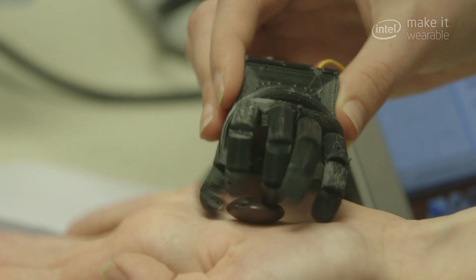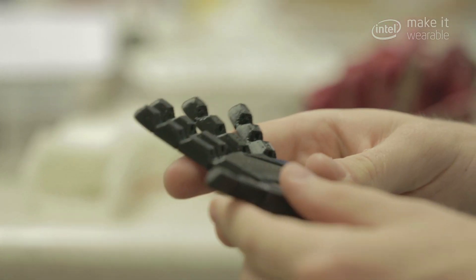Jacqueline was saying that if she had a robotic hand, she just wants to be able to tie her hair back. It's such a small thing that we all take for granted, but it makes a huge difference to an amputee.